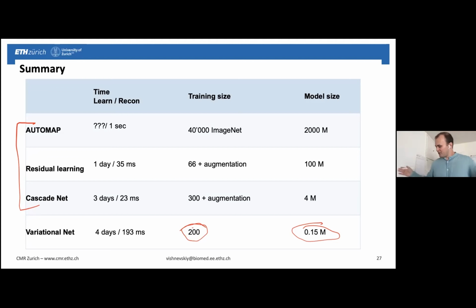Okay, so now the main confusing part is over, and I will talk through the further extensions of the variational networks and their applications. So just remember that our approach is to provide a prototypical optimization problem for image reconstruction, then choose the method to unroll and use some intuition from the numerical methods to add degrees of freedom that make sense to the model.